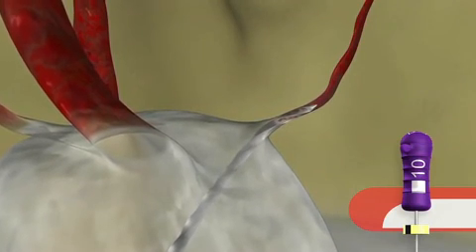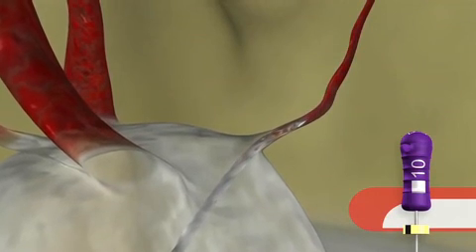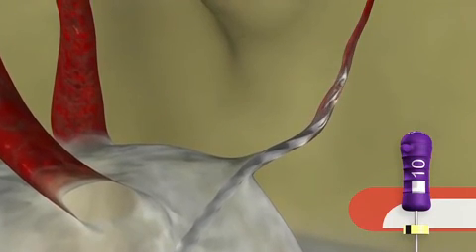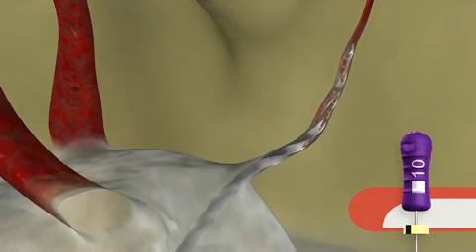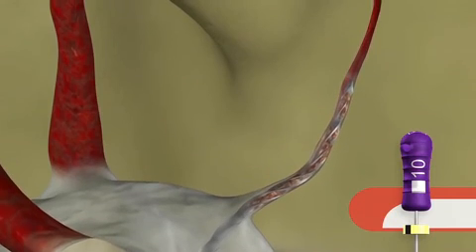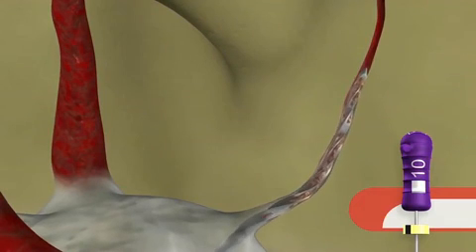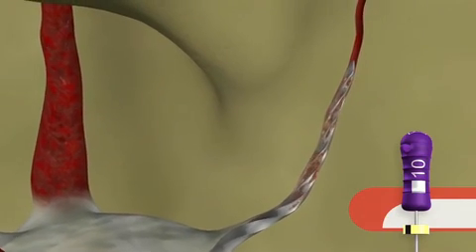The instrument is introduced into the canal, and in this case, the entry angle into the pulp chamber is quite abrupt, so a little gentle back and forth reciprocation on the handle will pull the file down into the canal. When we reciprocate the handle, it feeds the file progressively deeper into the canal. When the handle is snug, pull. Each feed and pull is a cutting cycle, and after every few cutting cycles, move the instrument up and down vertically in little short 1 millimeter amplitude strokes.